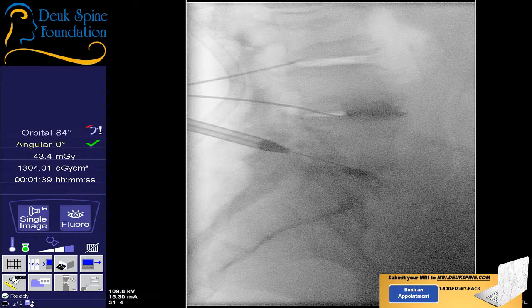There's too much movement artifact. There's something shaking. Oh, it's her breathing. All right, shot. Again, you get a blurrogram. All right, that'll do. It's not ideal, but it's adequate.